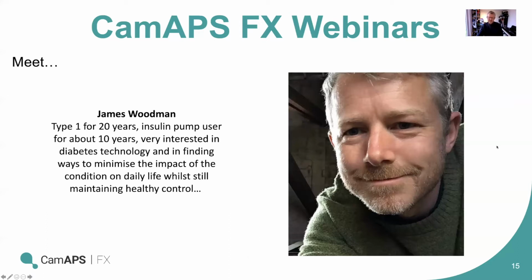And that simplicity applies to exercise too, because there isn't that much that you can adjust with this system. You've got the ease off setting that backs off the insulin delivery a bit, and that's about it. I really like that, and I find that it actually makes exercise pretty straightforward to the extent that it can be with type 1. If I can go on to my next slide, please, Candice.